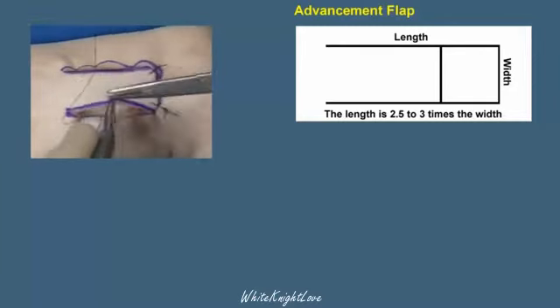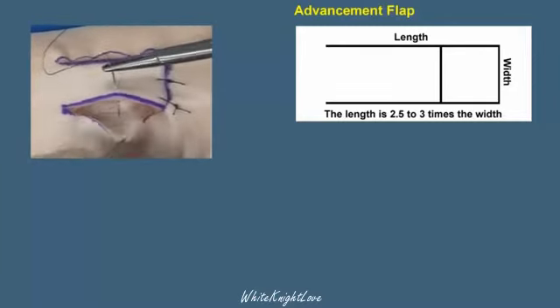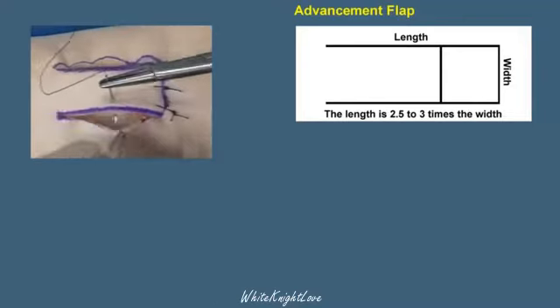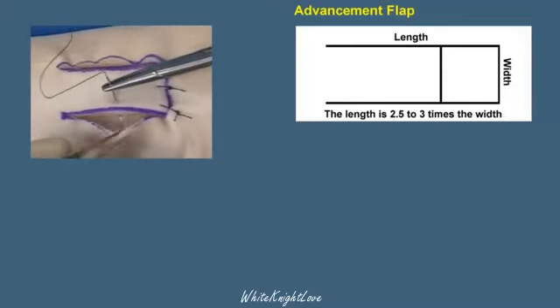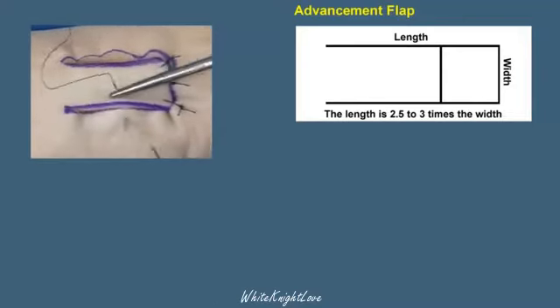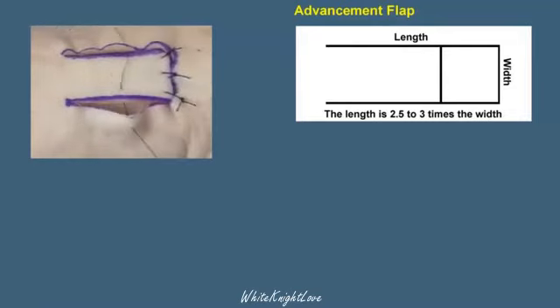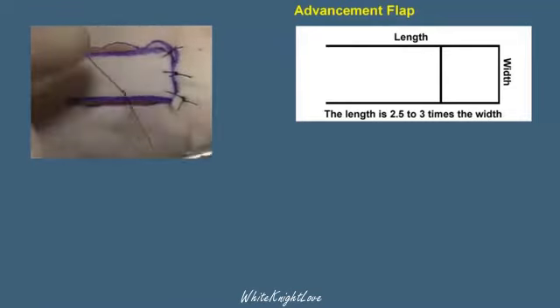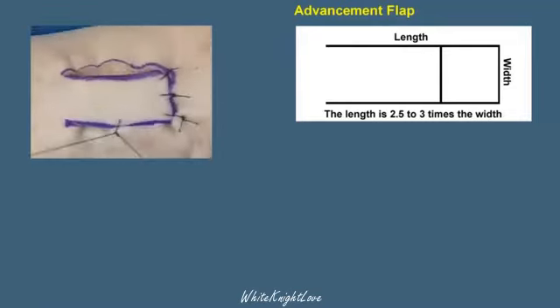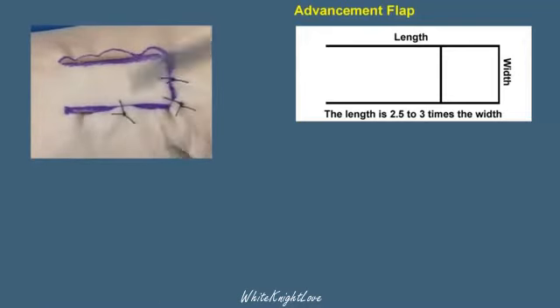And now we have a problem of unequal skin edge length. The skin edge is longer than the flap edge. We will then close this with the principles of halving. The first or central suture is placed in the middle of the inferior edge of the flap and in the middle of the corresponding skin flap.